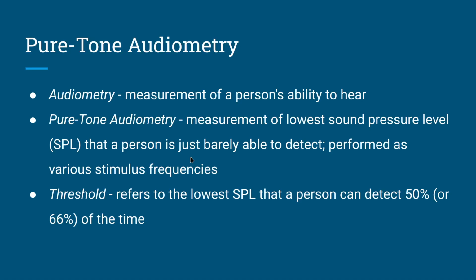We're measuring pure tones at a variety of presentation levels, at soft presentation levels in particular, but it's not intended to measure how well a person is able to hear in everyday life. It's intended to measure the loss of audibility for that person. Hearing in everyday life involves complex auditory processing, whether that's in the periphery or the central auditory nervous system. It includes important cognitive contributions.